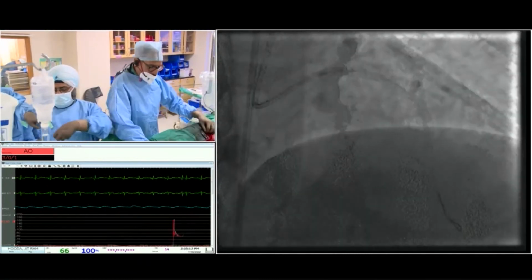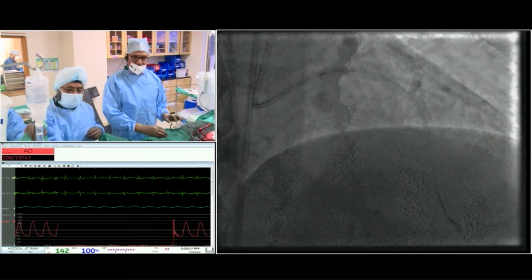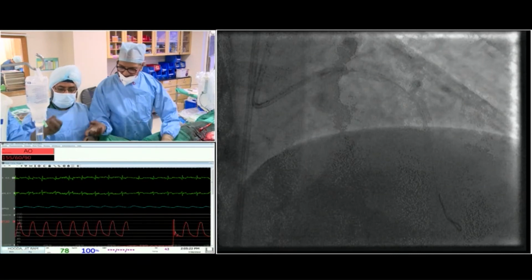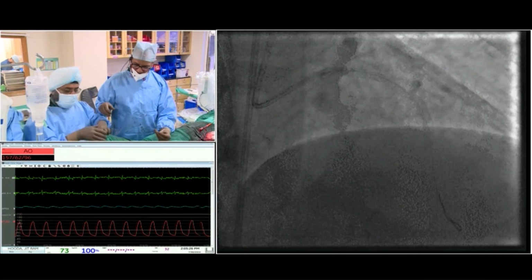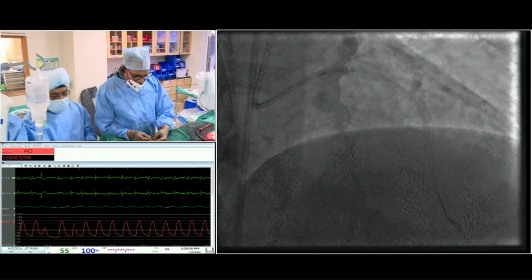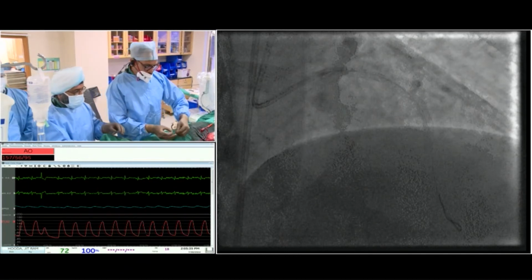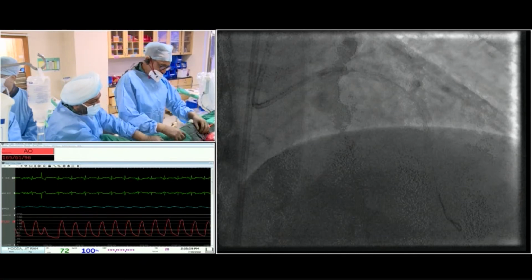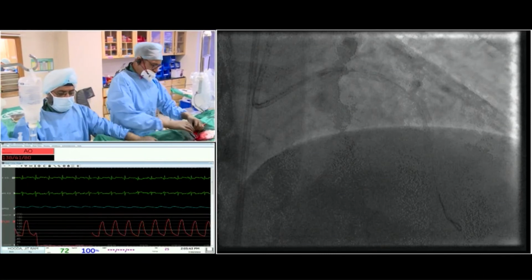So I'll give you an IVUS run image now. Dr. Ajit sir, earlier there was a strategy of damping pressure here, but when you do a crossover, what is your strategy? As I said, we'll do it only if it is absolutely essential. The same thing, I don't open it unless absolutely necessary. You are doing IVUS now, sir? So this is the final run of IVUS, and then I'm done. You can then move to Mumbai for Ajit Menon's case.